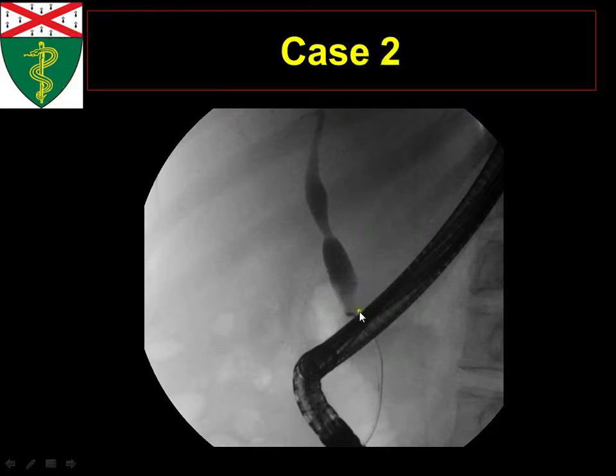All right, so over here we inject the bile duct. And I don't think we see too much of the bile duct nicely here, but I can understand why you think it may be a little bit narrow. Assuming this is okay, I think what you're referring to is this little waist over here, right? It comes across, narrows, and goes big again. And so absolutely, look at this, and I think you need to think that there's a stenosis.